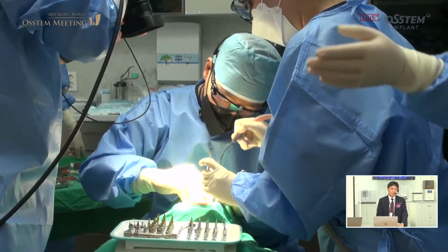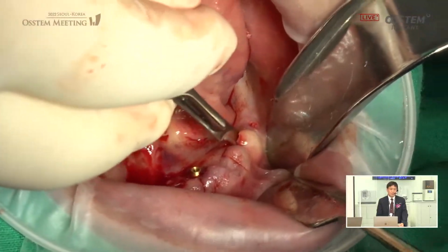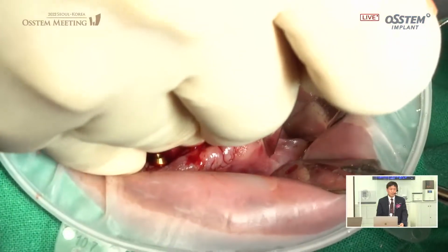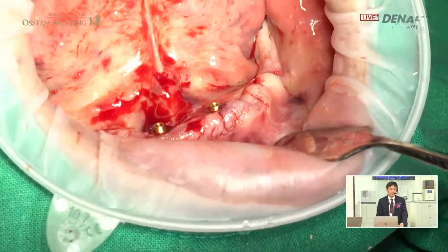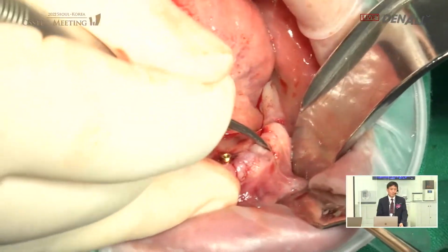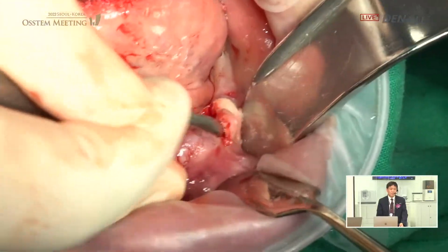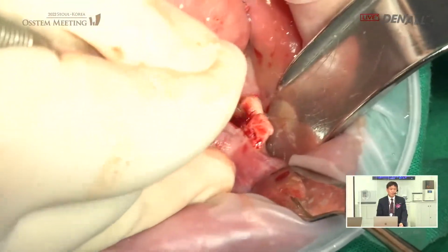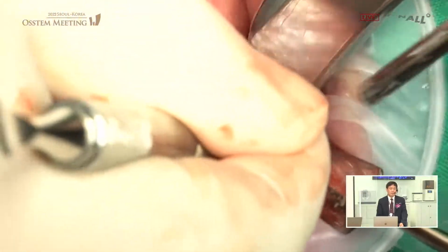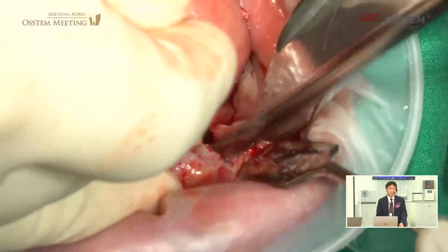The tilted implant in the posterior area may have exposed bone, so it may not be easy to put the abutment on. I'm going to form a mini flap to check the bone. On this side, it's an extraction socket, so it does not open as nicely.